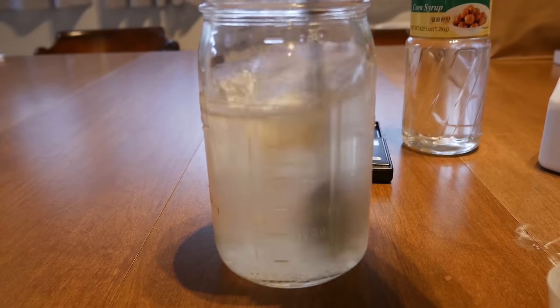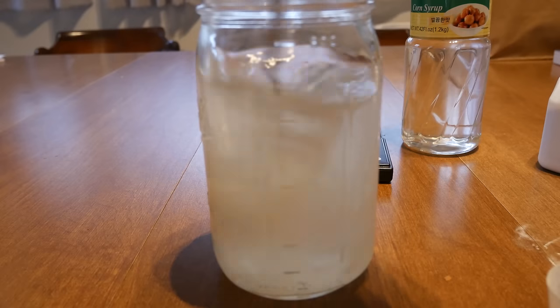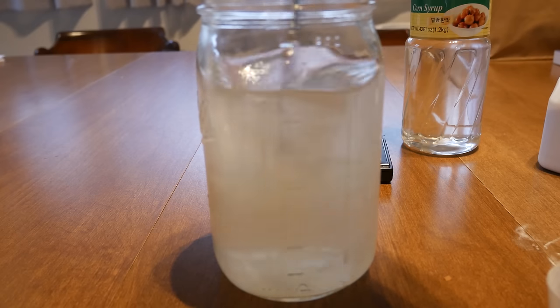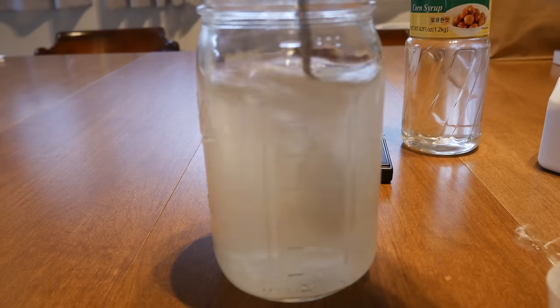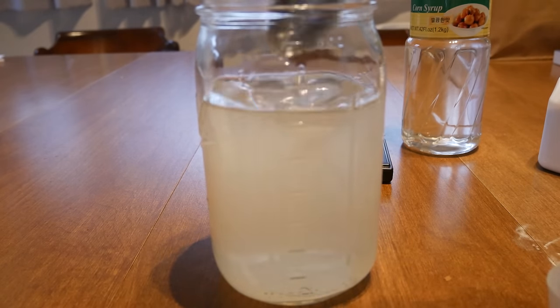With everything in, we want to go ahead and stir up our mixture to get it evenly mixed and dissolved. The corn syrup is going to be pretty sticky on the bottom, so mix this up very thoroughly to dissolve that corn syrup.